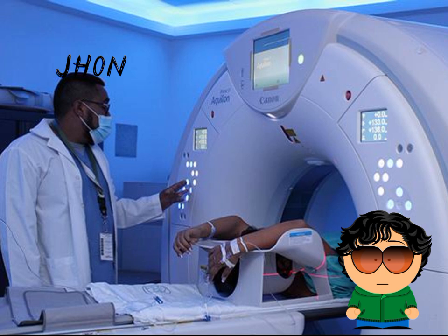Types of tomography. Computed tomography (CT) uses X-rays and computer systems to obtain detailed axial sections or images of the body. It is one of the most common types. Positron emission tomography, PET, a functional technique that detects metabolic activity in tissues, is used in oncology and neurology. Single photon emission computed tomography, SPECT, is similar to PET but uses different types of radioisotopes.